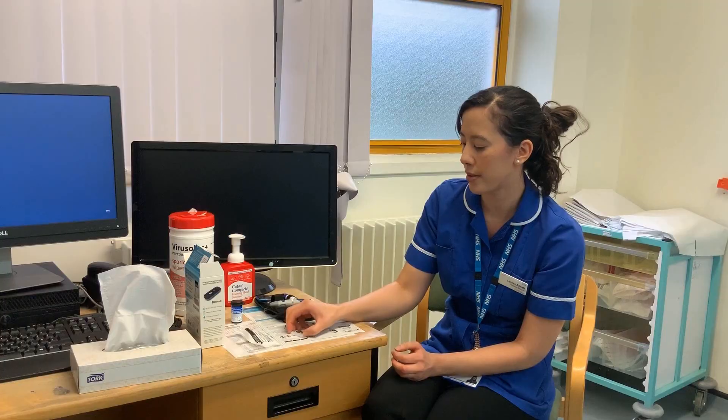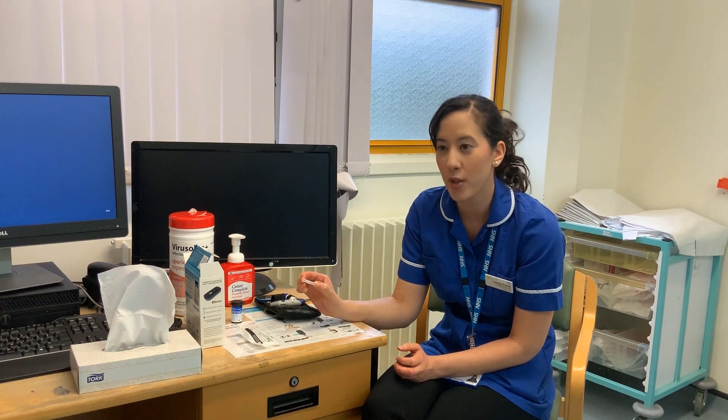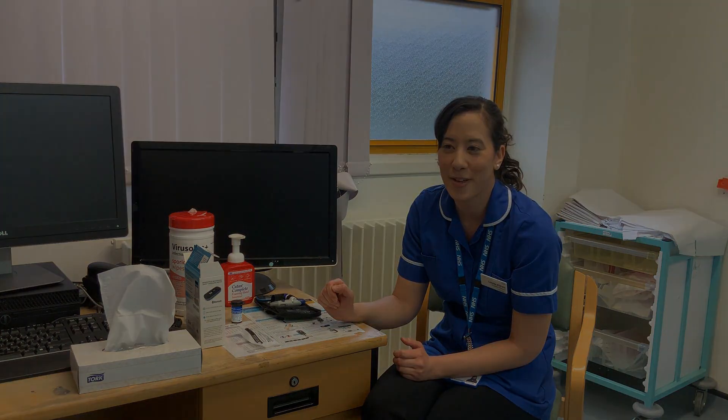These needles, once used, must never go in the normal household rubbish. They must go in the yellow sharps bin, which we will provide for you. And that's it — any questions, we're always here. Feel free to contact us.